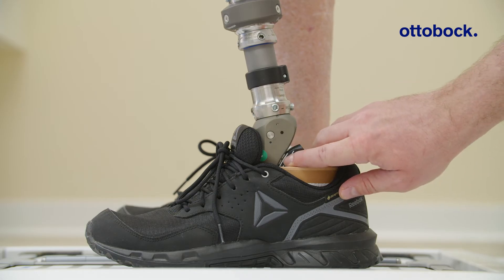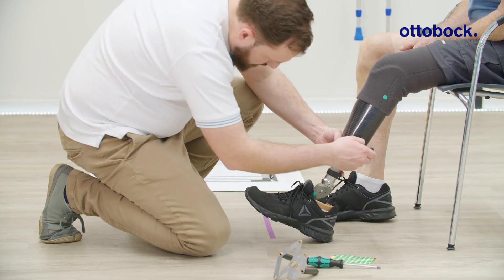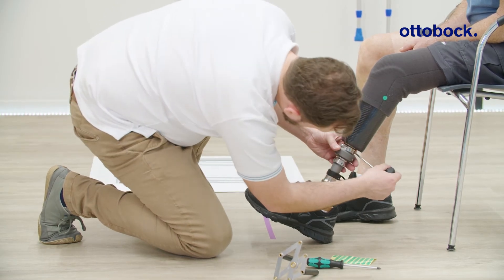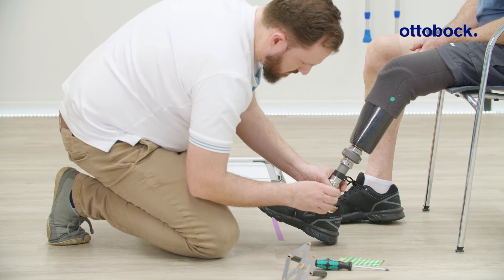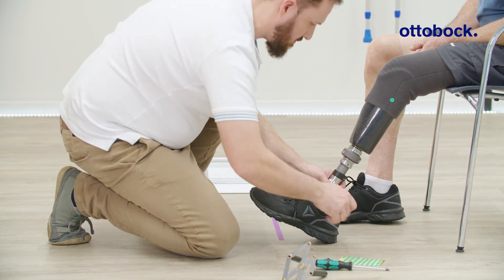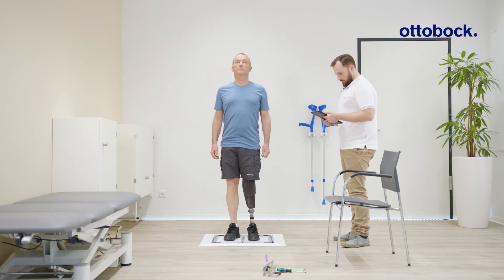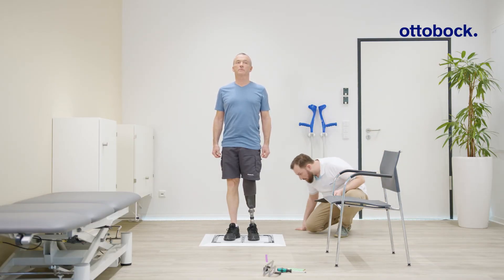As the user is clearly standing against the dorsiflexion stop, the CPO is conducting a parallel forward shift of the prosthetic foot by utilizing the proximal and distal adapter screws. Check the situation again with the help of the angle indicator lines and the 3D laser posture tablet.